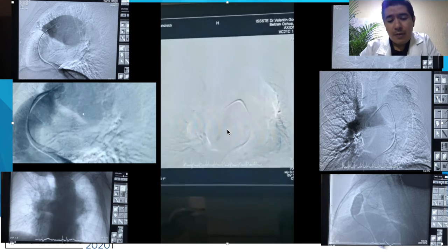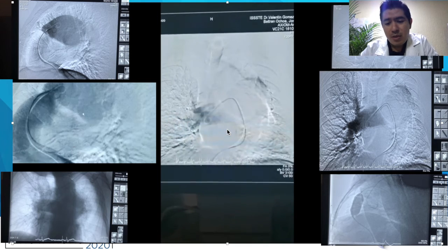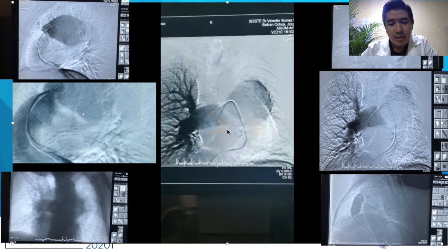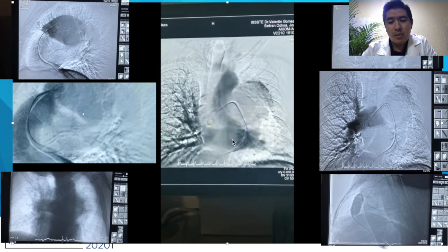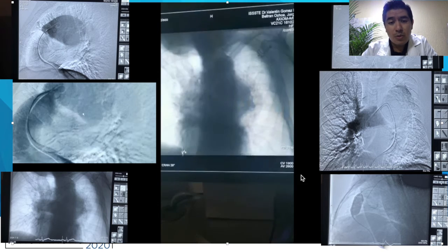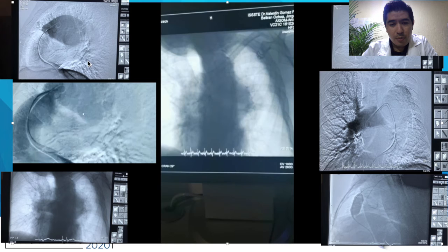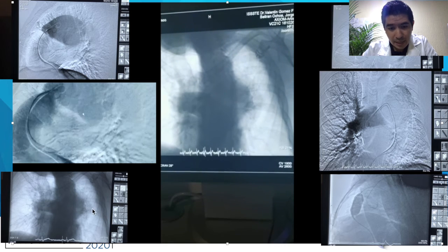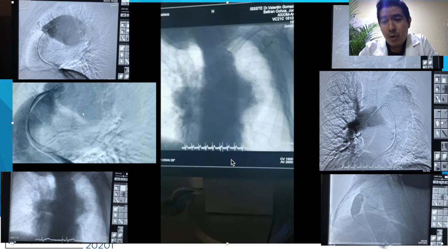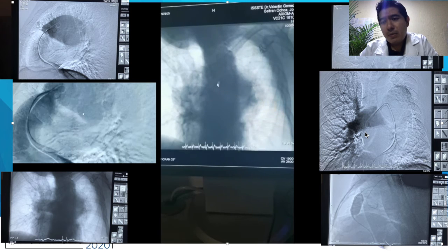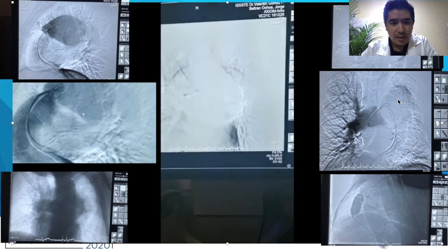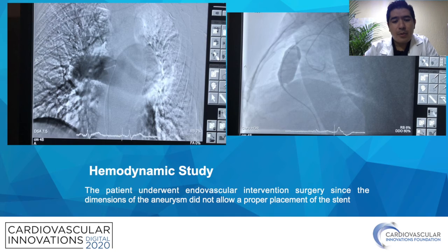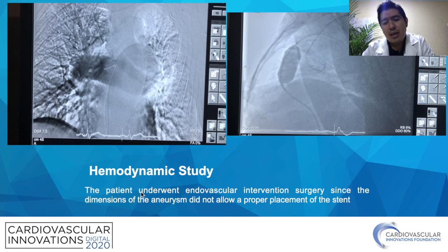Unfortunately, the measurements indicated the need to achieve endovascular intervention. The image and the size were considered the most important findings of the study, which showed the intraluminal pressures of the artery and the vessel wall defect of 12 cm. In this slide we see different images of the procedure, and the captures where the measurements are evident.